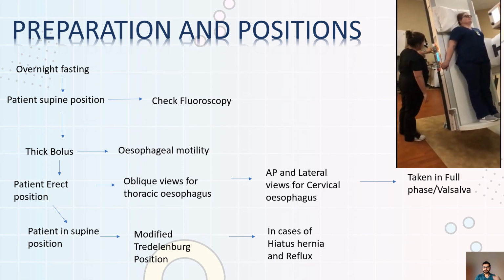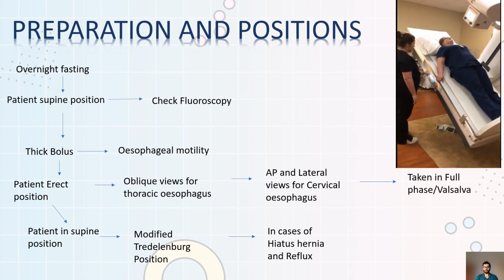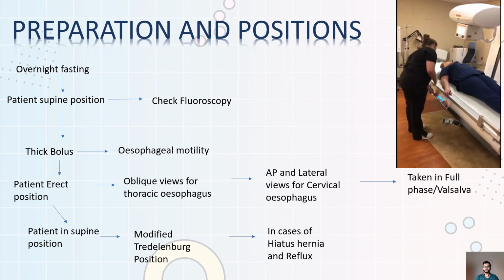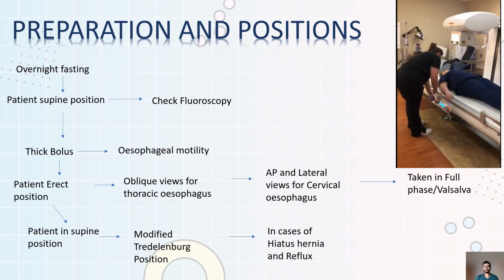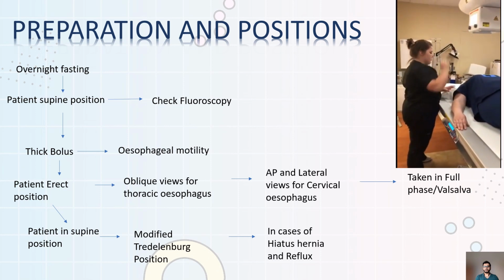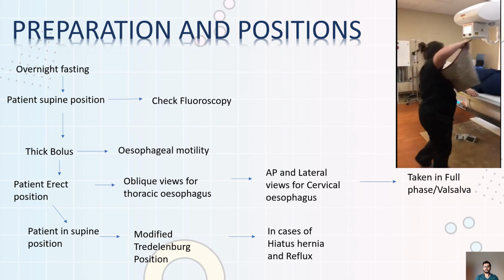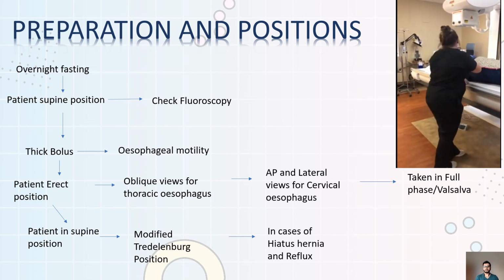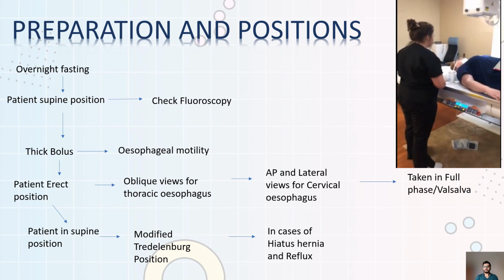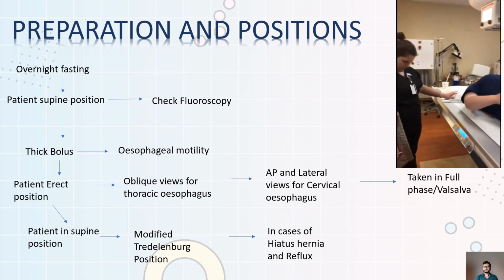Now the patient will be put in supine position. Radio protective cover is put to prevent any harm to vital structures.